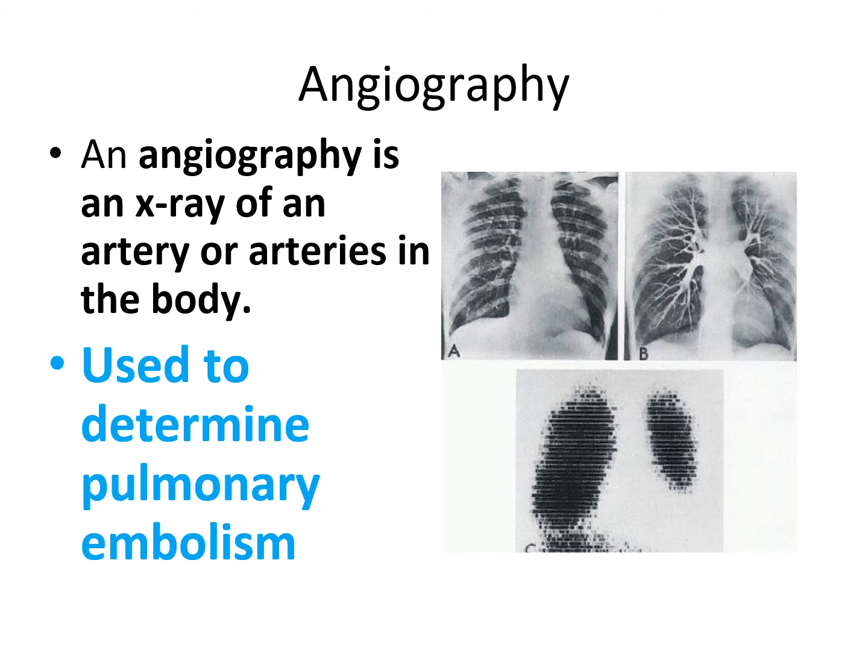Angiography. They look at this to see if there is a blood clot, if there's a pulmonary embolism. So they can look at the X-ray of the arteries. This is where they would use contrast. They would have to do this through a pulmonary artery to use the contrast. So this is really not done so much anymore because it's too invasive. But we used to do it this way.